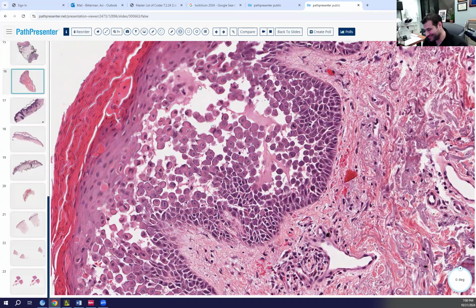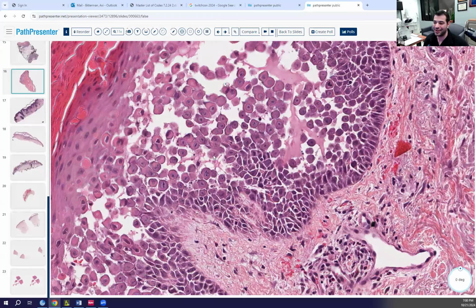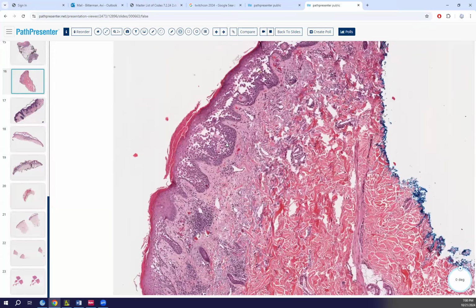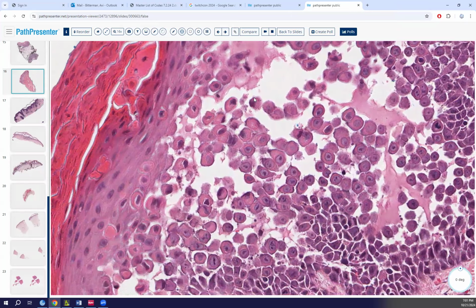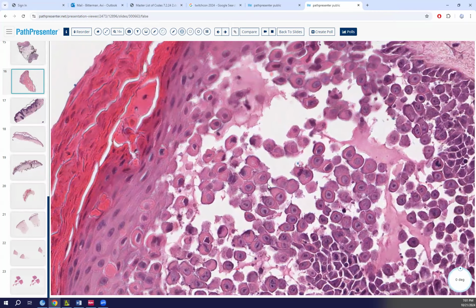So what's the diagnosis? Darier. Okay. But notice that there's more acantholysis than all this dyskeratosis. And also what's the color of the corps ronds? Red. It's a lot of red. They tend to make more red than blue corps ronds for some reason. Can you just point out a corps rond for me? Yeah, look at these. This one's actually starting to try to form a grain. When you imagine this just flattened out, it turns into a grain. Got it.